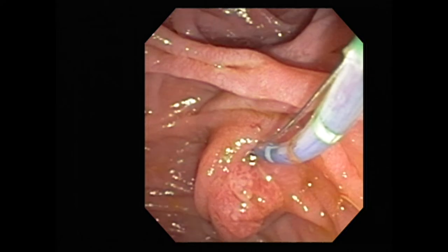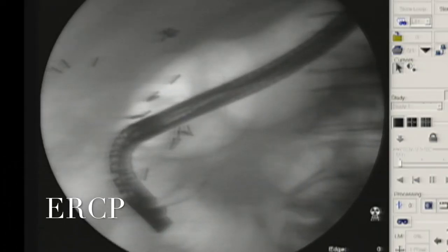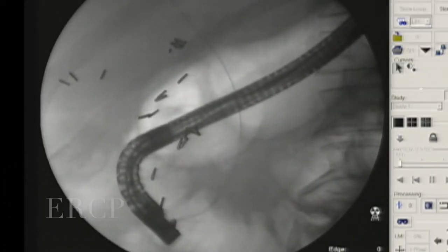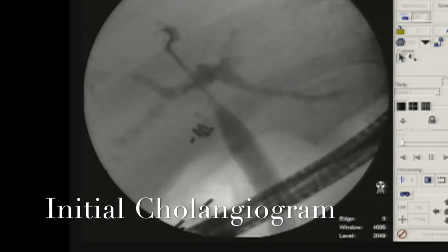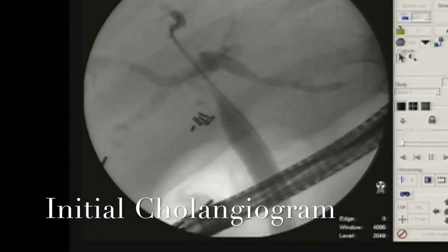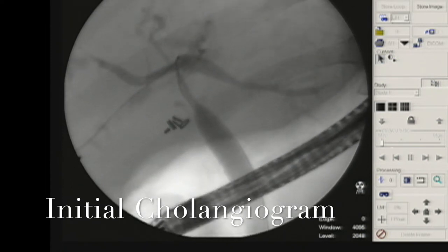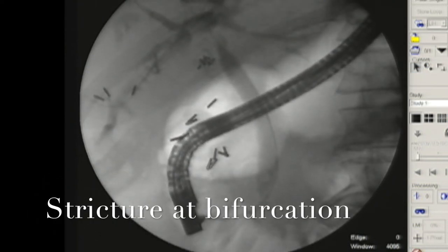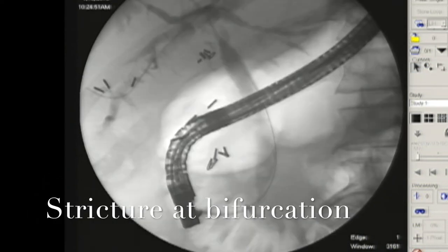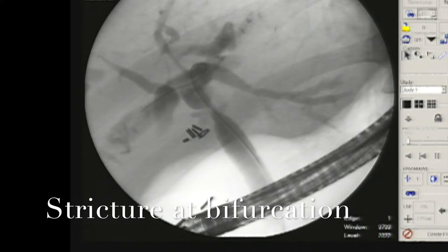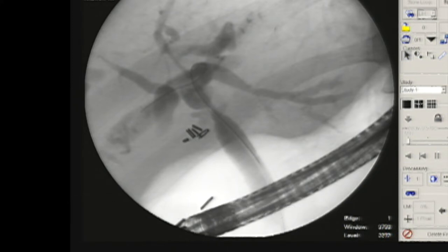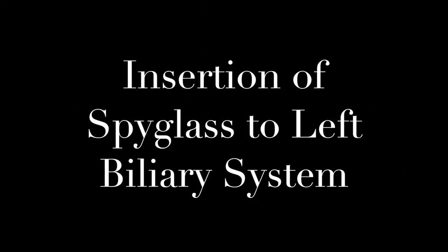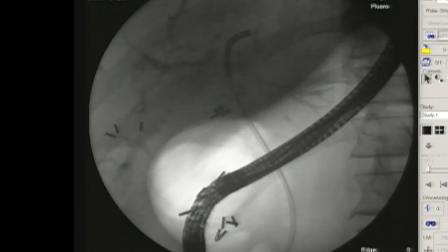Here we turn to the case itself. We're removing prior placed biliary stents from the outside institution and cannulating the bile duct. Here's a standard view from ERCP — the guidewire has advanced up through the stricture and we see the initial cholangiogram, which shows a stricture involving the common hepatic duct and the left and right main hepatic ducts. As you can see, it's very difficult to determine with ERCP using contrast or PTC using contrast the total extent of the tumor with precision. Therefore, SpyGlass cholangioscopy is used to determine the longitudinal extent of the tumor.